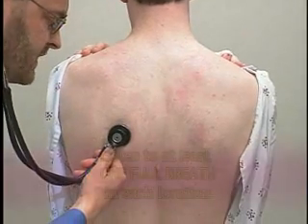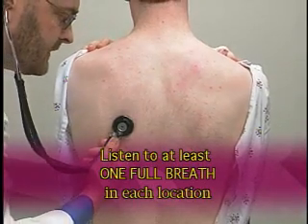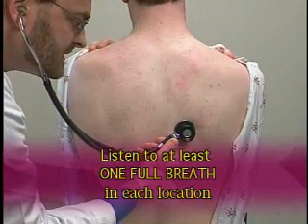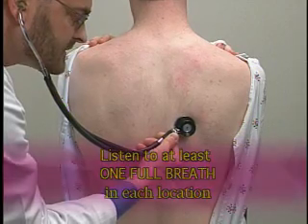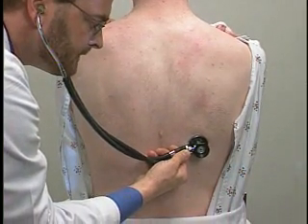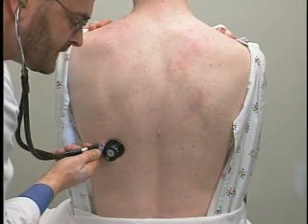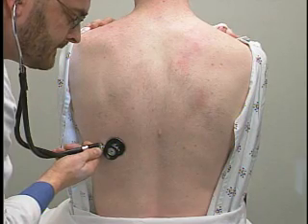It's very important to keep your stethoscope on the chest wall during the entire respiratory cycle. The patient needs to complete an entire inspiratory and expiratory cycle. When expiration is complete, move your stethoscope quickly to the opposite side.